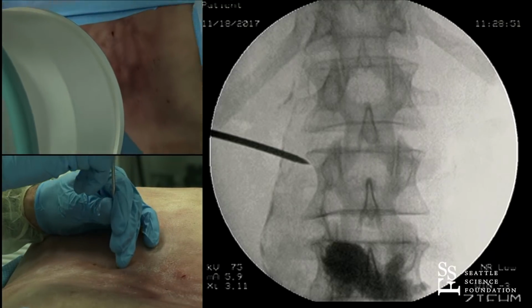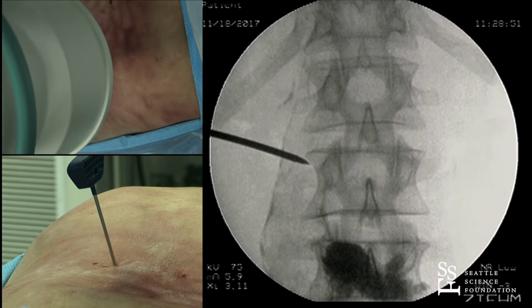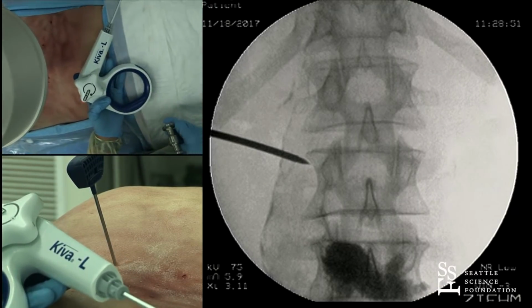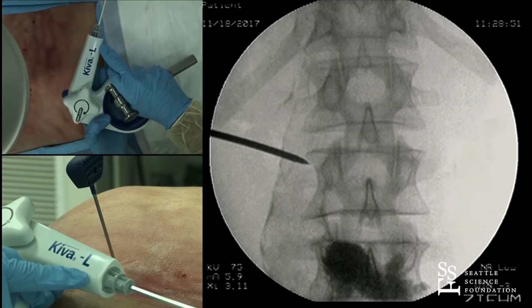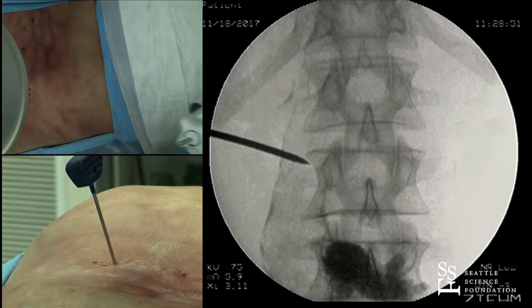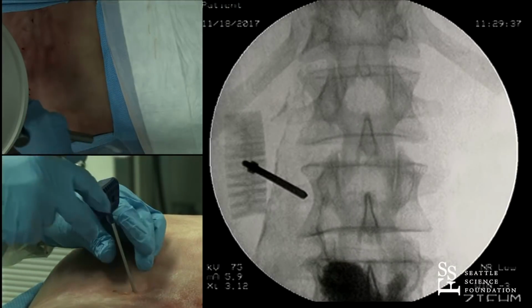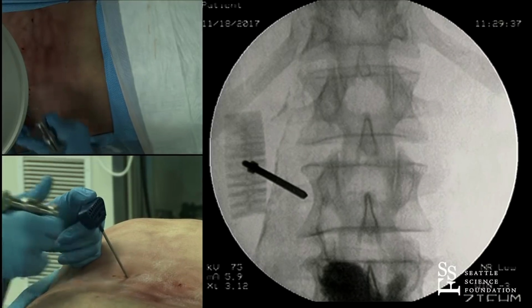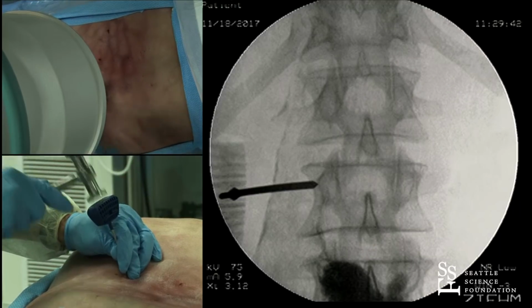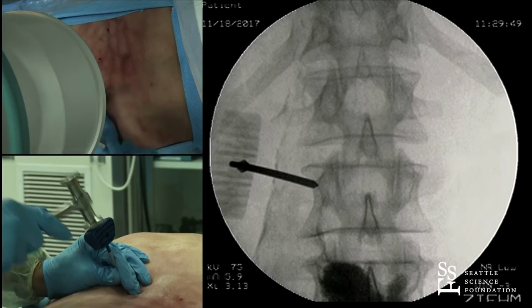And one of the things that you have to be familiar with, this is a different animal. So the Kiva device comes, we're accessing the left pedicle. It comes with either a left or right. So this has an L on it. This is the left pedicle. And we're accessing the left because this will go from top to bottom. And it's a different direction on the opposite side. So these are made to go to a specific side. On this approach, this will be fairly similar to a transpedicular approach, but just a touch more flat rather than the top to bottom kind of approach that we saw previously.